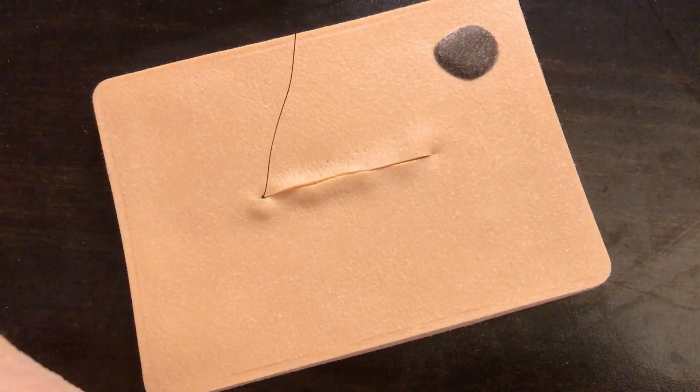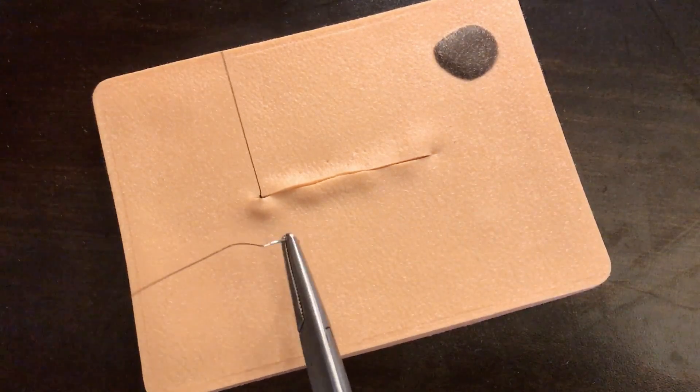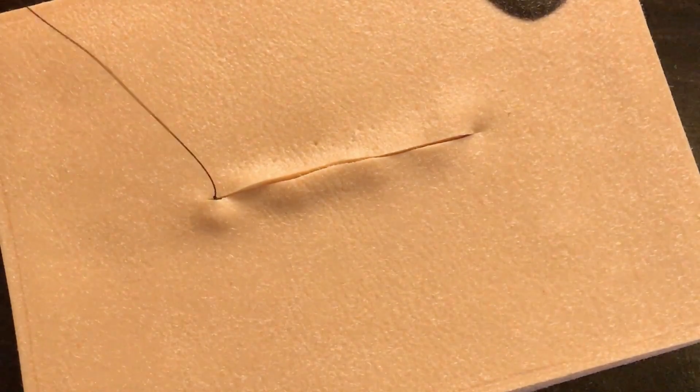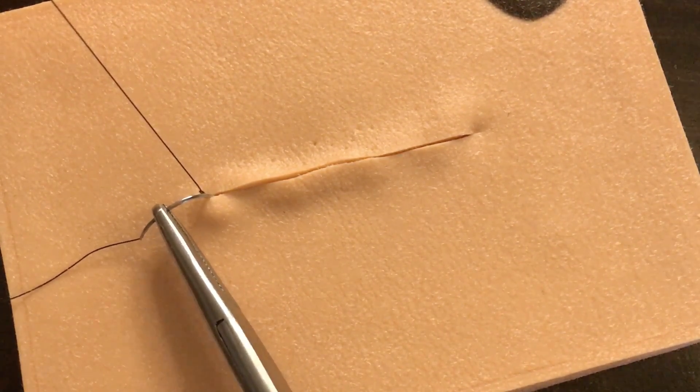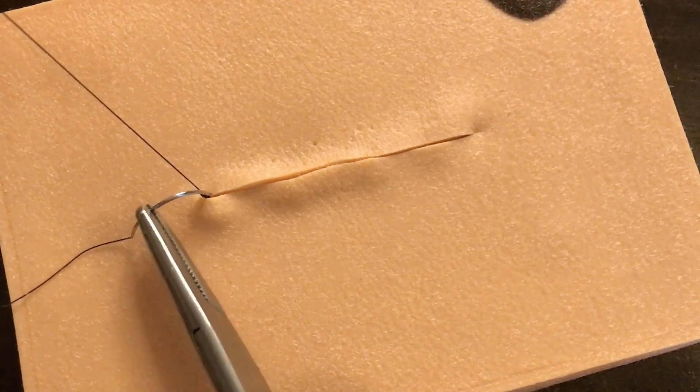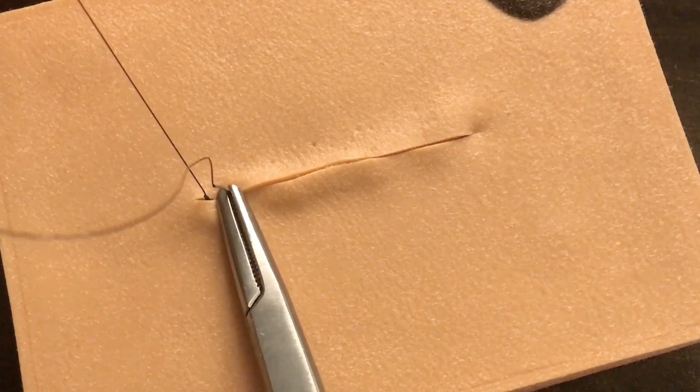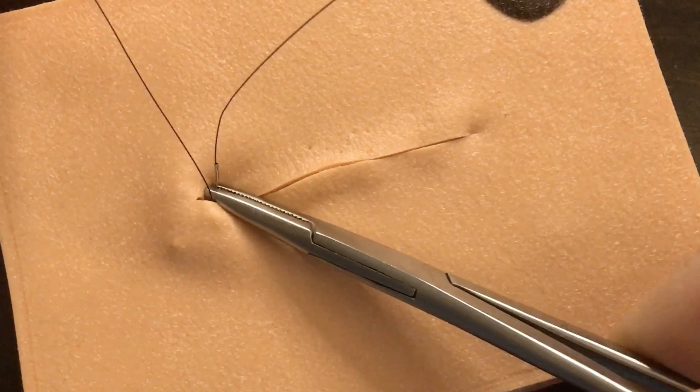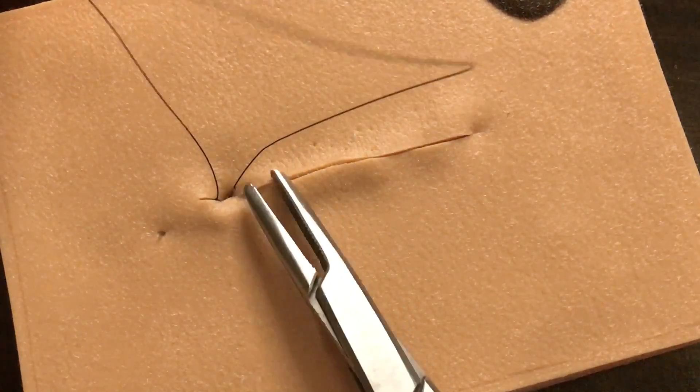So I'm going to load up my suture with my needle driver. Now with my left hand, I'm going to lift up on that so I can very clearly see where the knot is. Let me zoom in so you can see it well. Very clearly see where the knot is. And I'm going to go just above, meaning just to the right side of this knot, and I'm going to slide my needle down along the side of it so I know I'm under the knot rather, and I'm going to turn my suture needle out here into the tissue somewhere. I need to grab it and push it a little bit more. There we go.